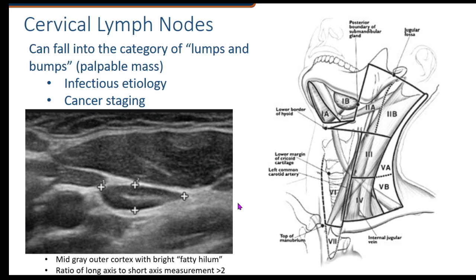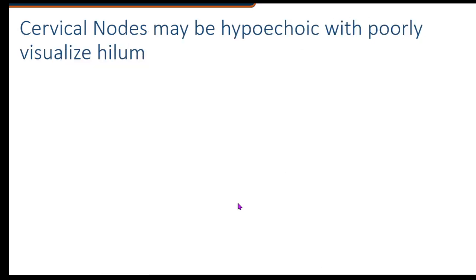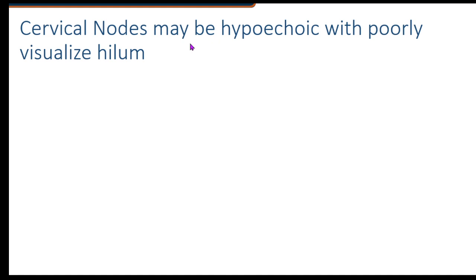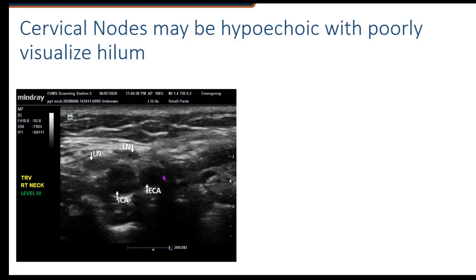When lymph nodes become reactive or have been infiltrated with cancer, they begin to get a more rounded or more lobular appearance. I want to caution you that cervical nodes may just appear as hypechoic, almost like little jelly beans. As you're moving up and down the neurovascular bundle with your probe, you'll see this little rounded structure come into view, pass by, and go out of view, then the next one comes into view because they're in chains. You may or may not be able to visualize the hilum.